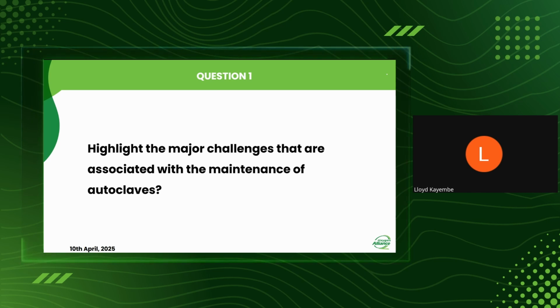And thank you for introducing this panel discussion. I would like to share one of the major challenges associated with autoclaves in general, according to the experience I have had working in hospitals here in Malawi. One of the things I have noted is the problem of blown-out heating elements. This has been one of the major challenges with this autoclave.